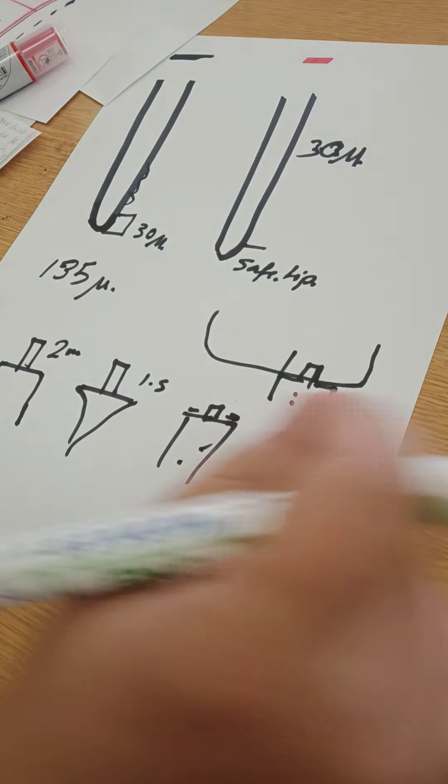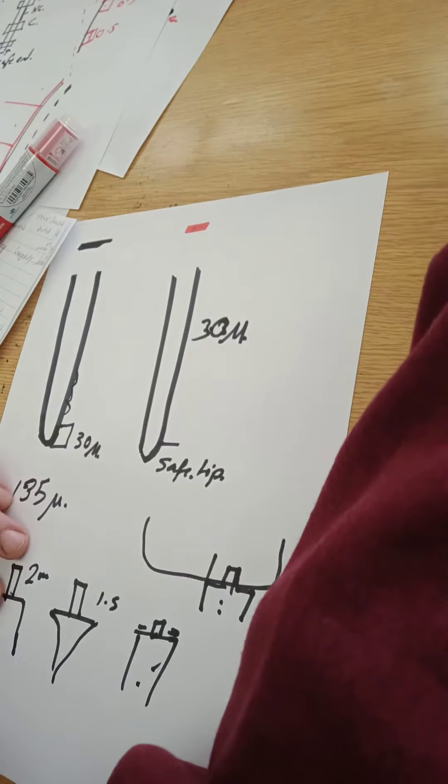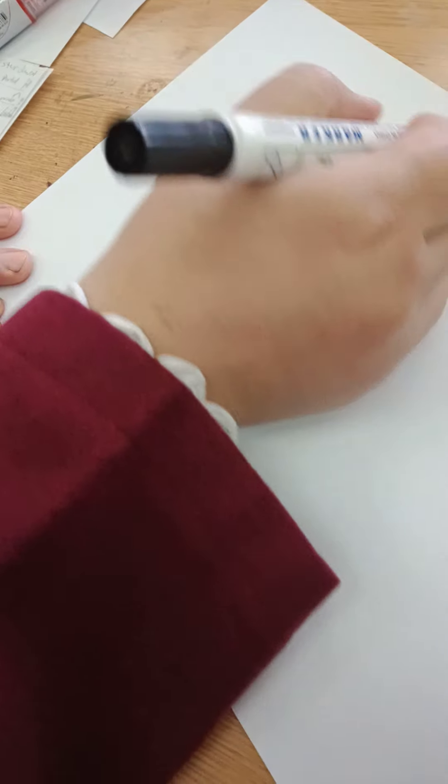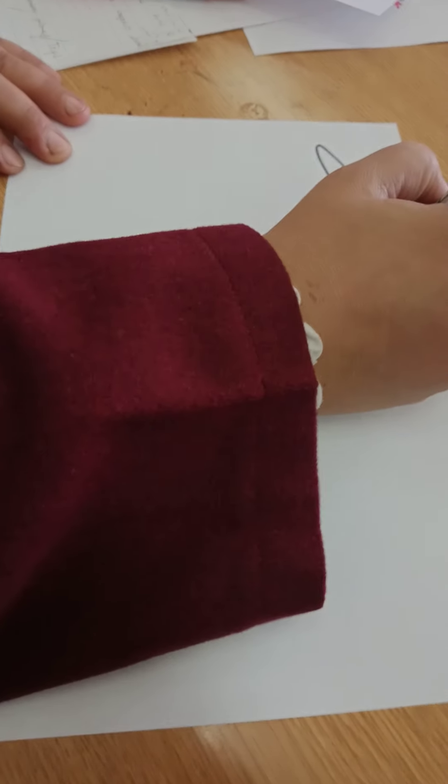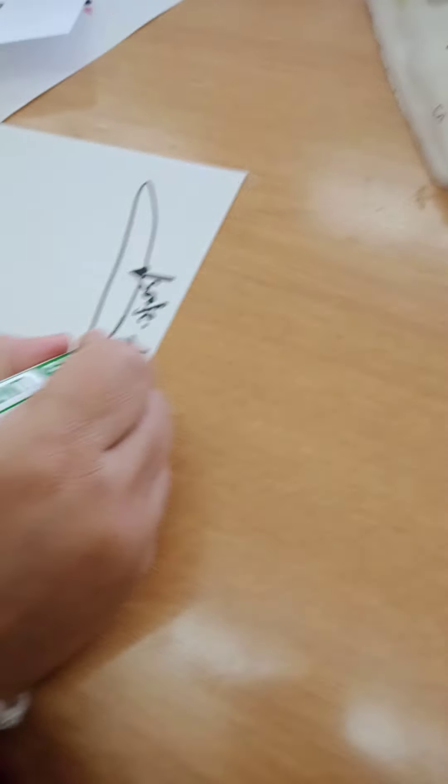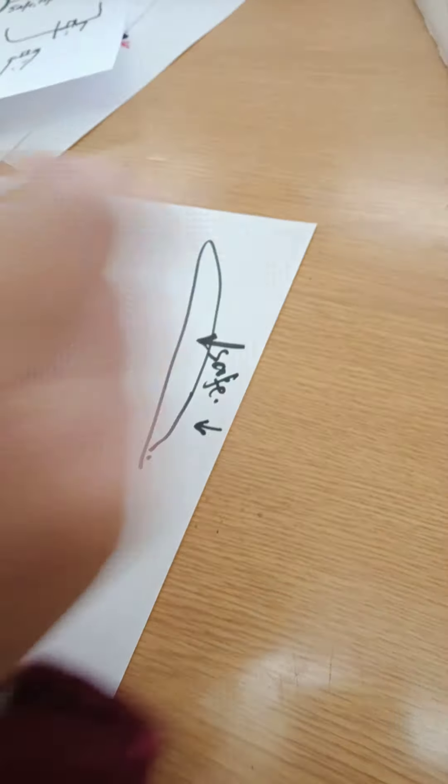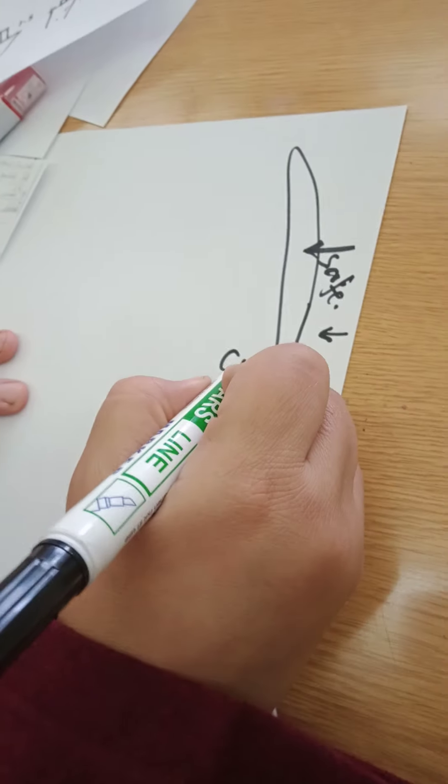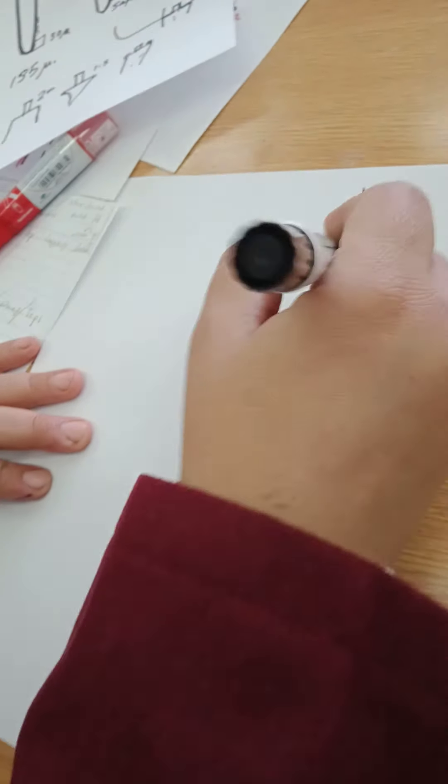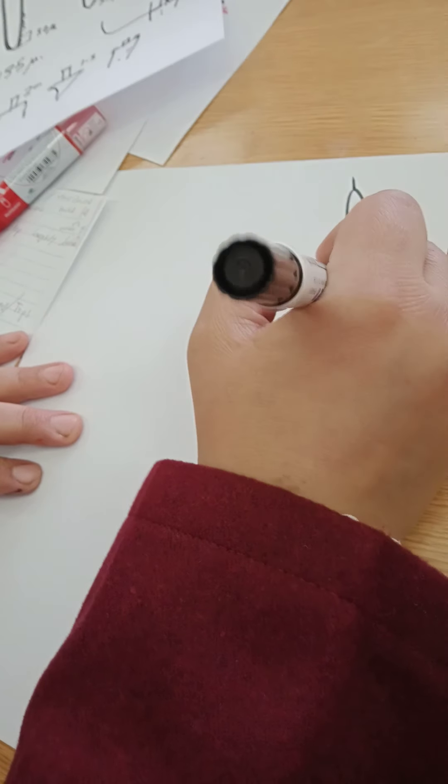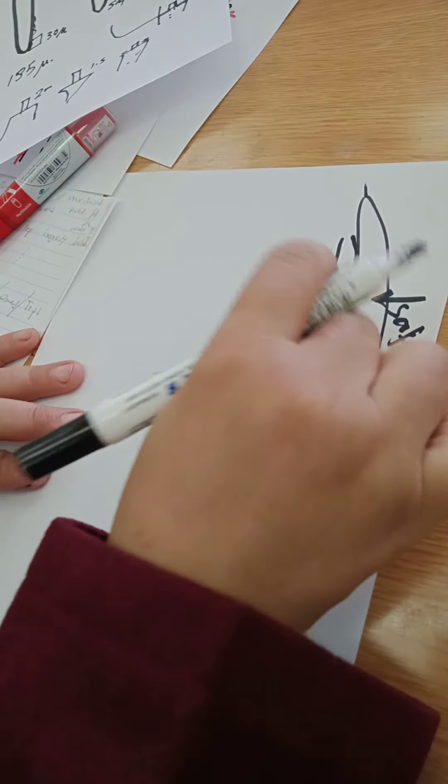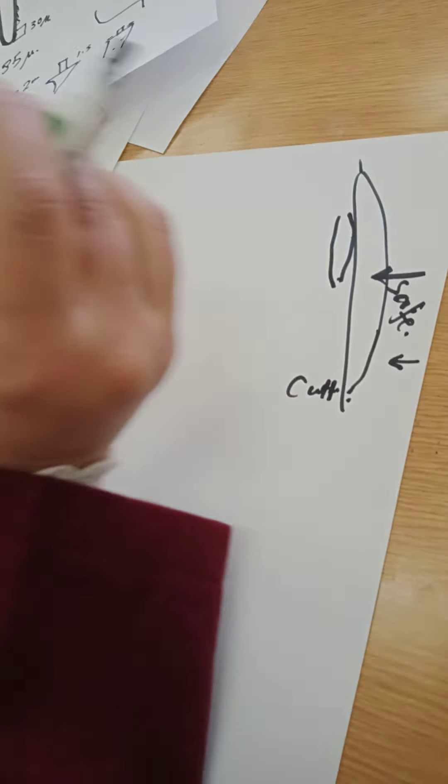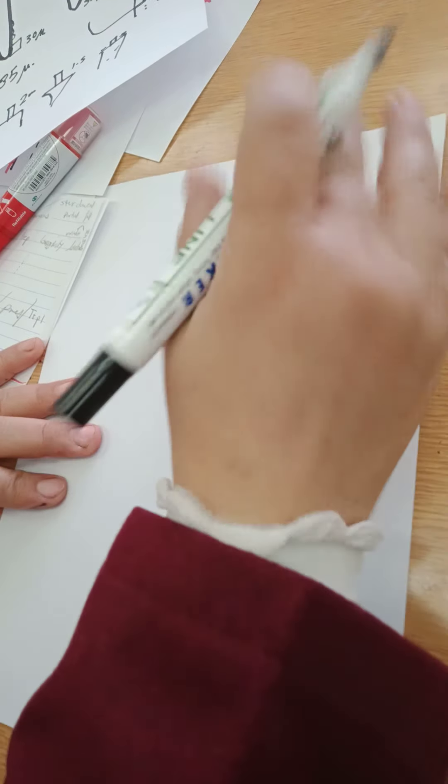So these are the burs. Then we have a final thing that we should include in our veneer preparation kit. It is a disc. It's a thin disc. Once more, it has abrasive material on it. It has a safe side. Why need a safe side? Because I don't want to damage the adjacent tooth. And it has a cutting side. Why do I need to have this? Whenever I'm placing veneers, even if I'm leaving the contact area, I should come and open the contact area with this disc. It's very minimal preparation. It's like enamel shaping.